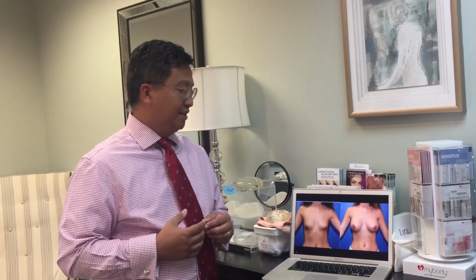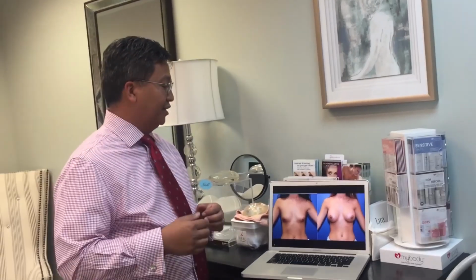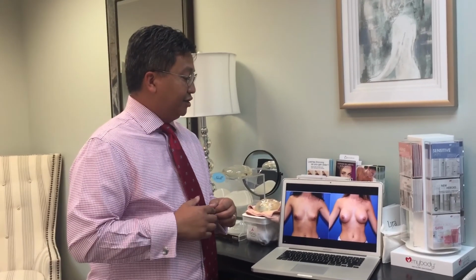Make sure that we're both on the same wavelength about what implants will work best for that patient, and it makes it so much easier to have that conversation. So again, one of my favorite surgeries to do, and I love to have people come in and try out their new implants on the screen. So the last thing I want to talk to you about is what to expect after surgery.